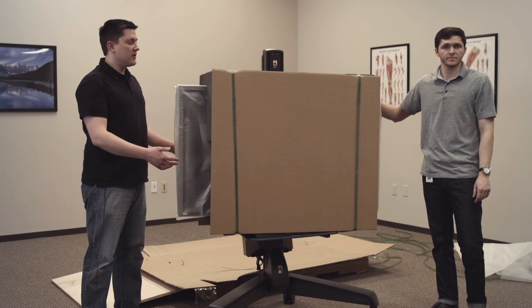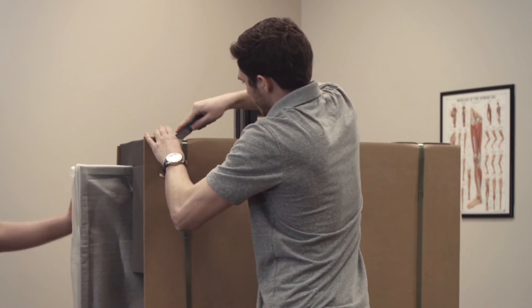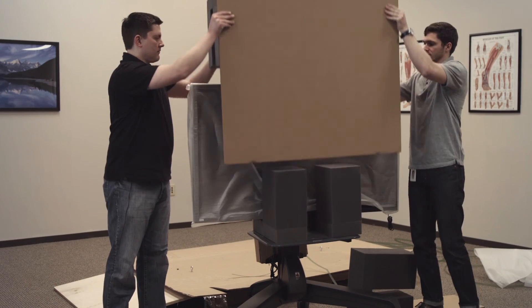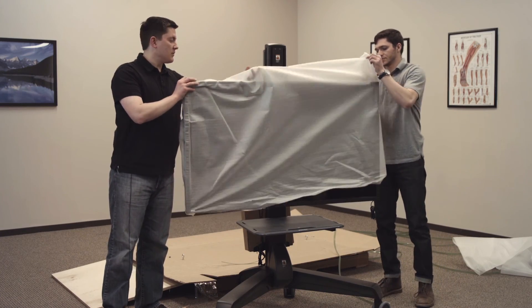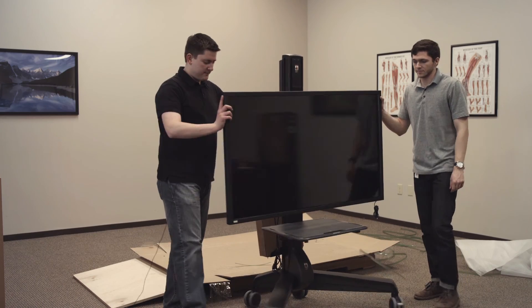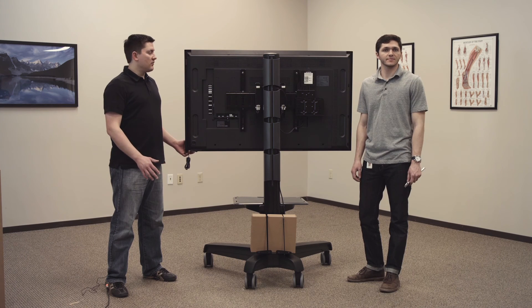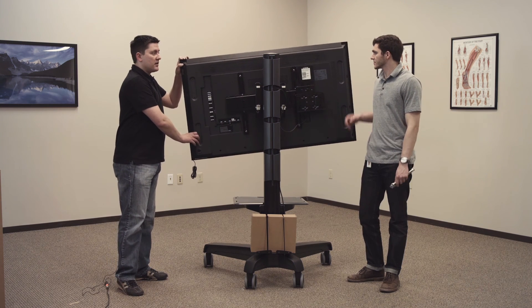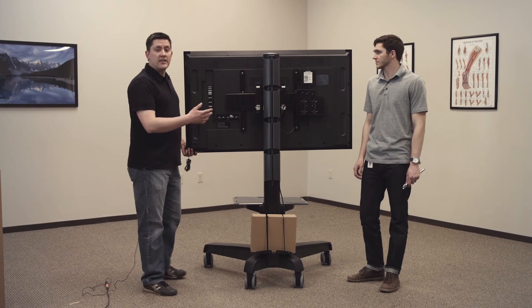Now we're ready to remove the foam and the cardboard. I'm going to start by cutting these straps at the top, and we can remove the foam wrap as well. I'm going to turn it around and show you the back. Now that we have the BITS system off of the pallet, we're going to show you how to make some adjustments to the monitor and the stand. The monitor can rotate — it was intentionally left loose — so we're going to tighten that.